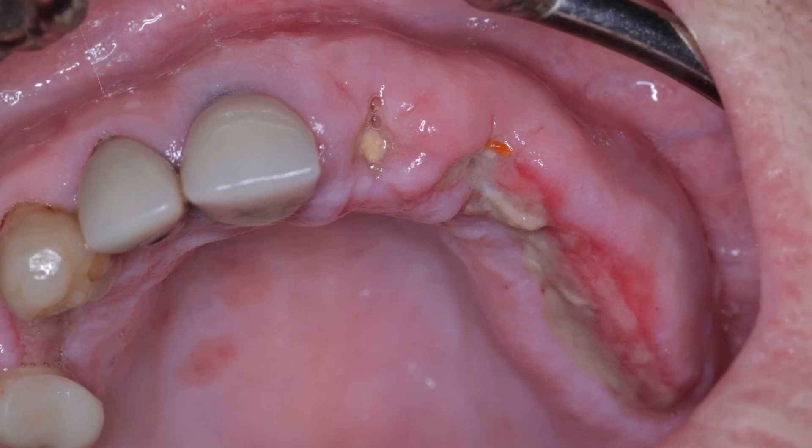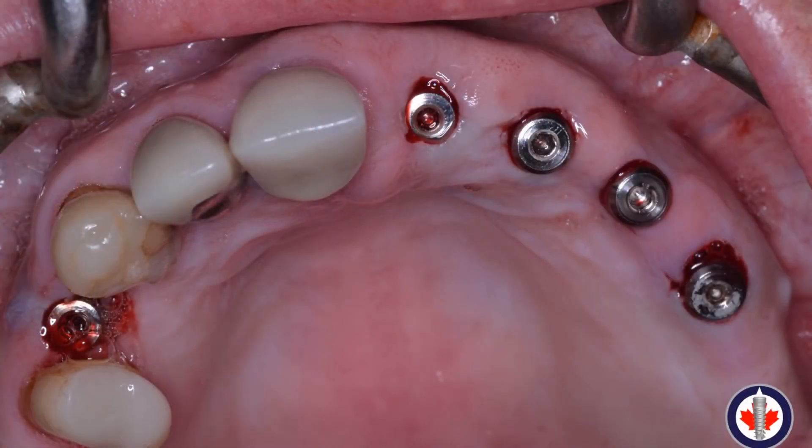Upon return for suture removal, you can see there is some sloughing of the tissue on the palatal aspect. When making the incision for the implants in the maxillary left, the incision should have been more over the ridge as opposed to palatally — ending up in a blood watershed area caused the tissue sloughing. The good news is that this leads to an increased amount of connective tissue available for the Stage 2 procedure.